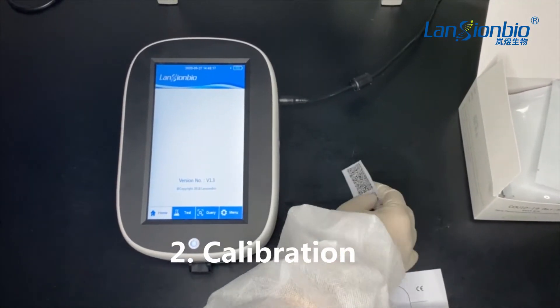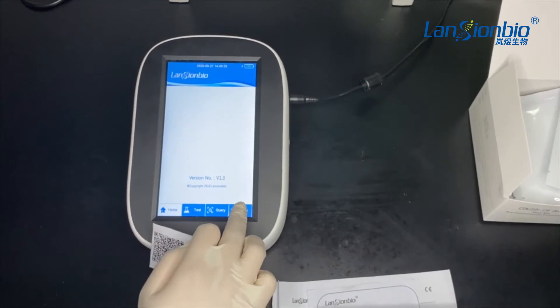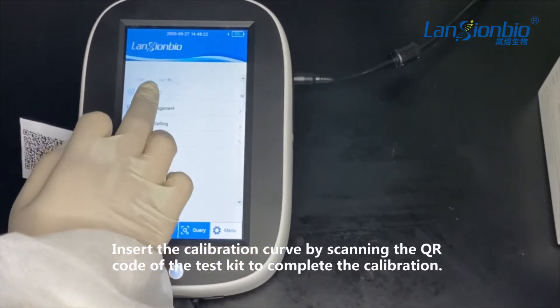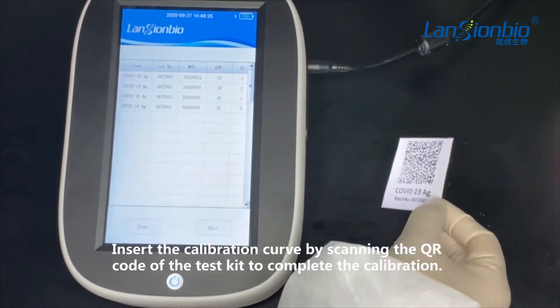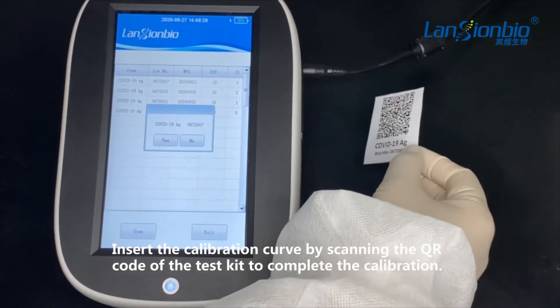Calibration. Insert the calibration curve by scanning the QR code of the test kit to complete the calibration, like what we do in the video.